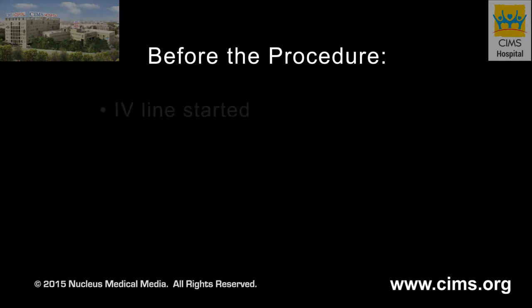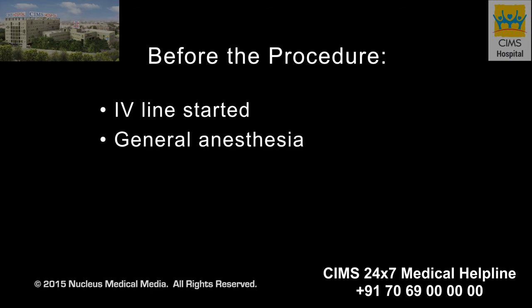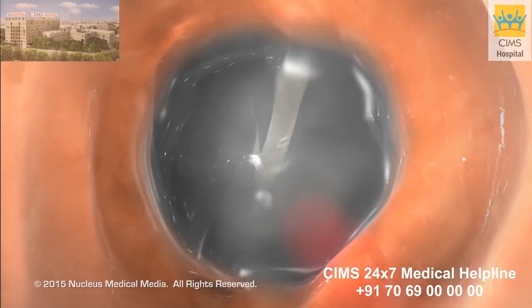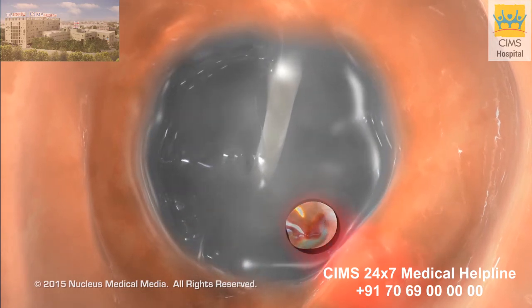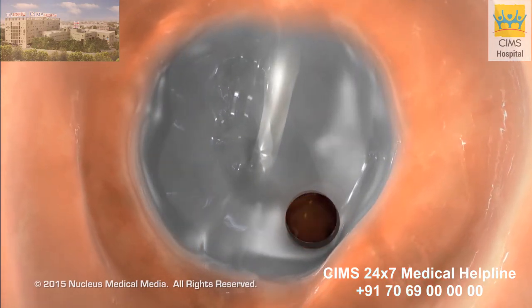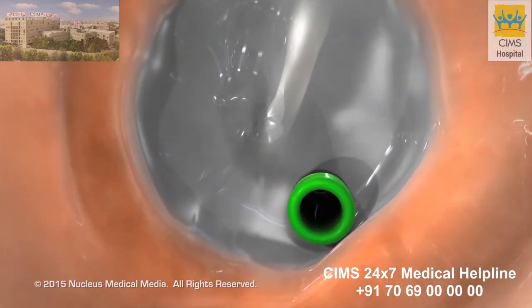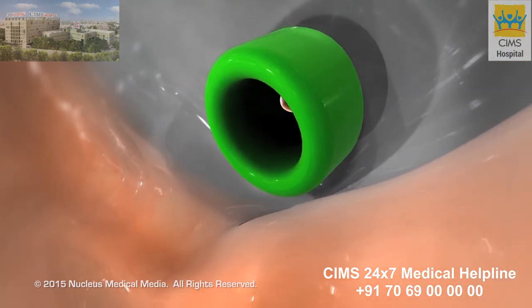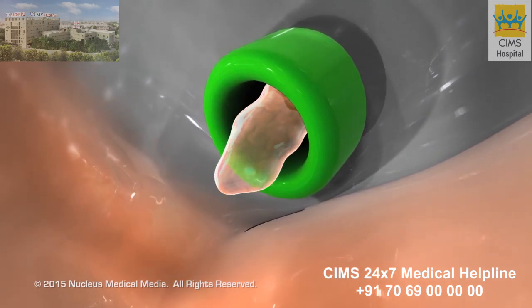Before the procedure, an intravenous line will be started. In most cases, general anesthesia is used to put the patient to sleep for the duration of the procedure. The surgeon will make a small incision in the eardrum using a scalpel or laser and drain the fluid in the middle ear. In many cases, the surgeon will place a ventilation tube, or PE tube, through the incision. This small tube will drain any fluid that collects after surgery and allow air into the middle ear to help dry it out.